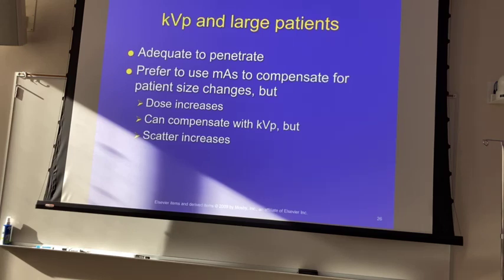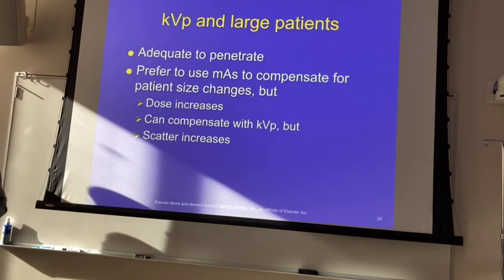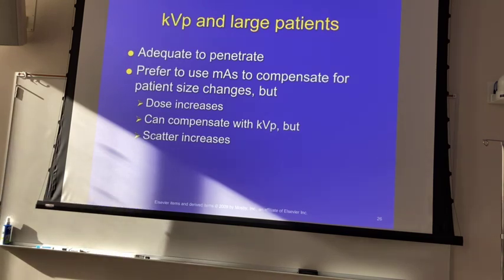If it doesn't make a change in the appearance of the image and possibly interfere with the diagnosis, then there's no benefit really in increasing mAs. Just increasing the mAs would increase the patient dose. Is increasing the kVp going to increase their dose? Yes, it is. But is it going to be as significant as increasing the mAs only? And the answer is no. Okay. So I think it'll probably make that change, possibly within the next 10 years. It may take a little bit longer than that.